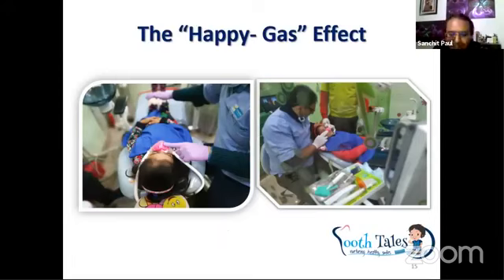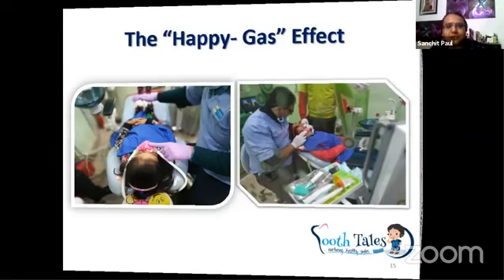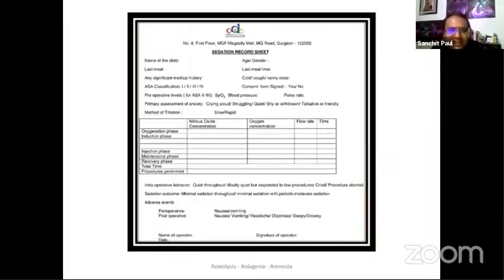this every day. We laughingly say that this gas is not a Mercedes which we have to bring out only rarely. This machine and this gas should be used on an everyday basis, especially not only as a last resort, but also to make sure that it can be used as a behavior management tool. We call it the happy gas effect, and that's how we try to do the sedation documentation.